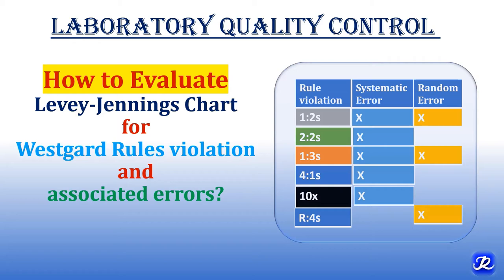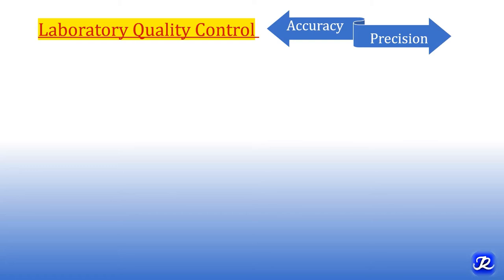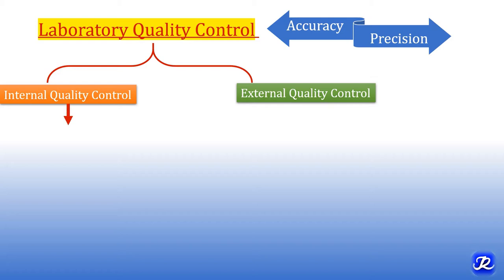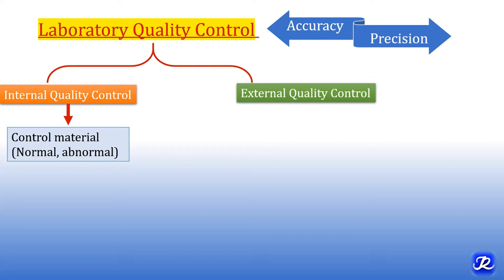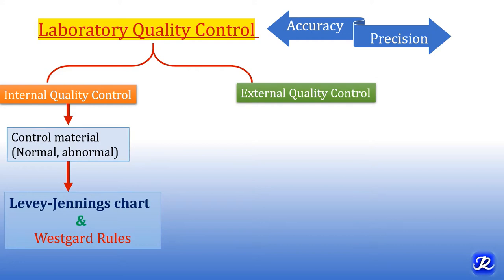In this video, let's learn how to evaluate Levy-Jennings charts for Westgard rule violations and associated errors. Before this, you should first watch the previous three videos on laboratory quality control. Quality control in a clinical laboratory is a statistical process designed to ensure accurate and precise results. Internal quality control is done using quality control material, cross-checking results with known values using Levy-Jennings charts and Westgard rules on a daily basis.